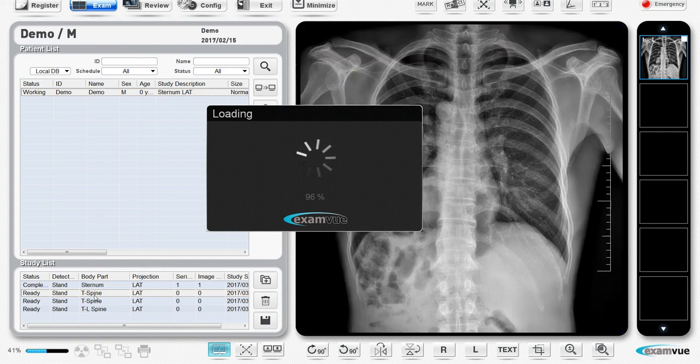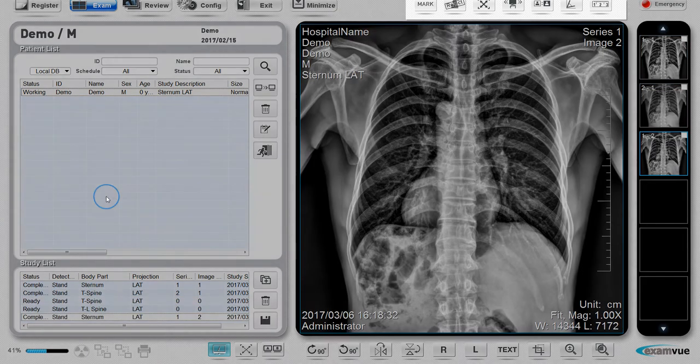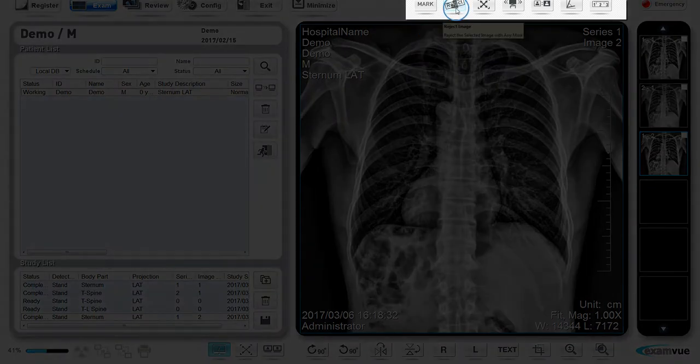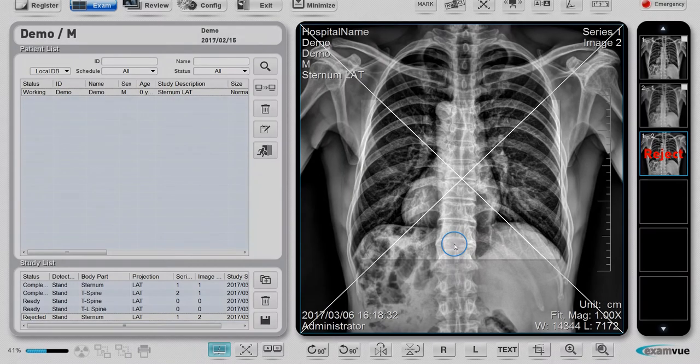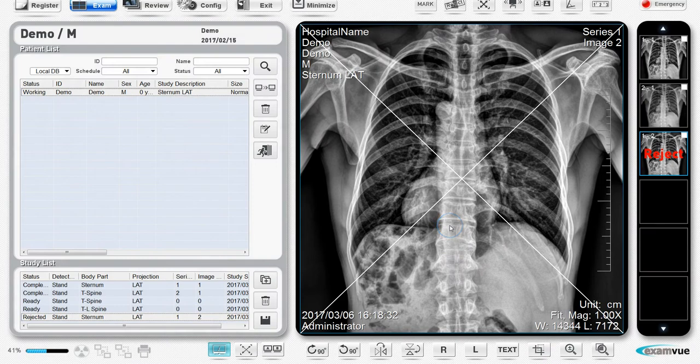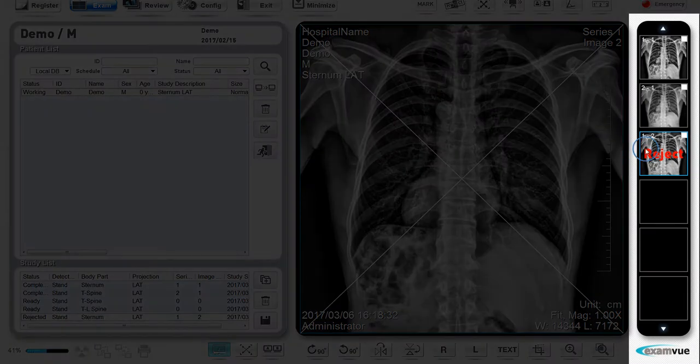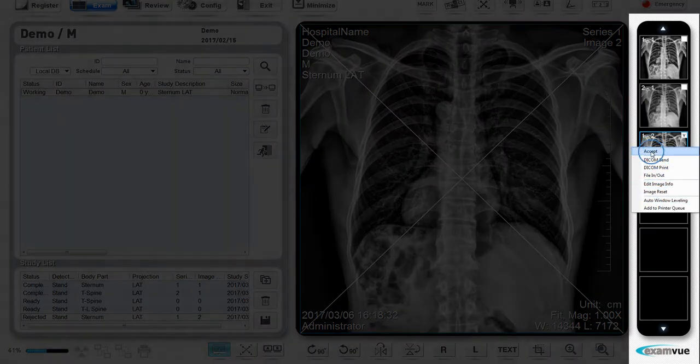To reject an image, click reject. You will have to enter the account password. Finally, enter the rejection reason. You can also accept an image that has been rejected in the past.